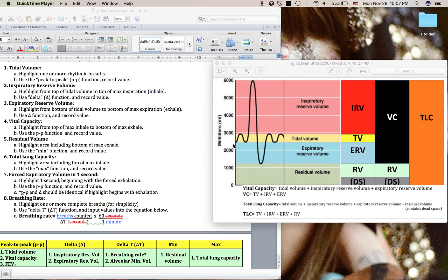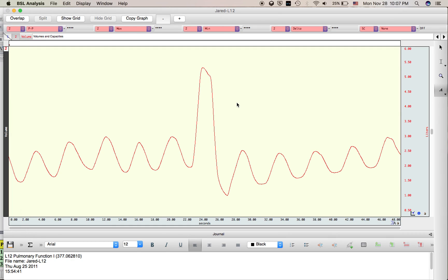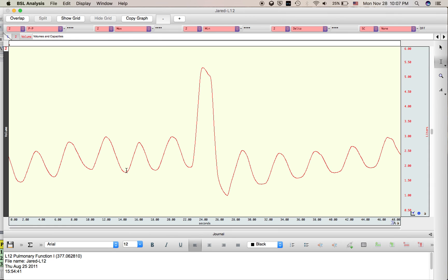Notice that the milliliters begins at zero and we don't have negative values here. This is the table to obtain all of these values. I'm going to open up the BioPak software and show you how to get each of them. This is Lab 12, so if you have the BioPak software downloaded, follow along.